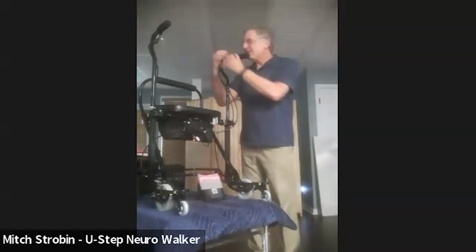Now, I'll go into a little bit of detail here, because questions always come up with this module. So when I push that red button, and I know you couldn't hear it there, there's some clicks that you hear before the light goes on. The clicks just tell you how long the laser will stay on. You hear between 1 and 7 clicks, or 4 to 28 minutes. So each click equals 4 minutes.